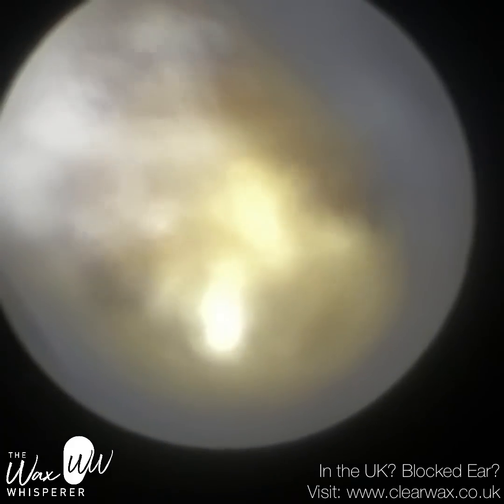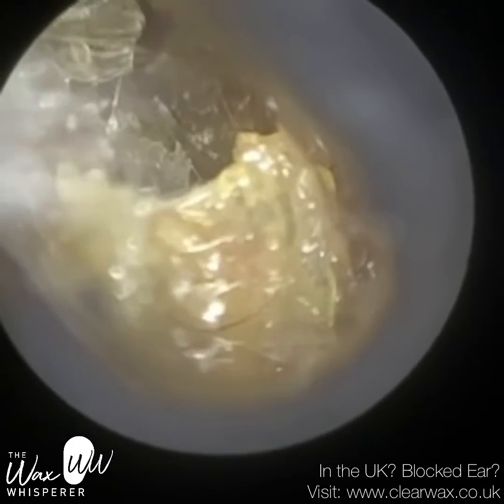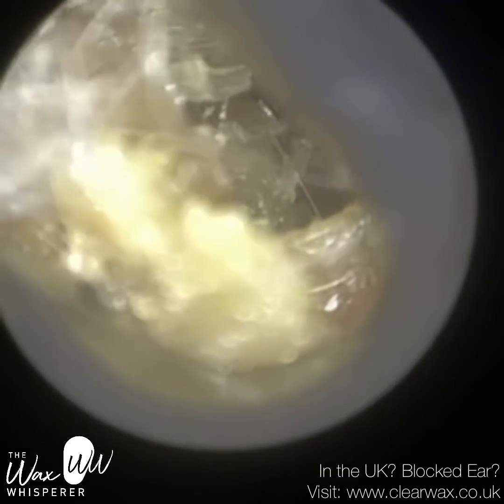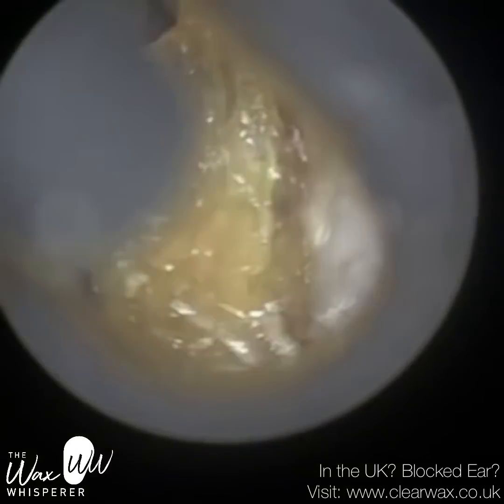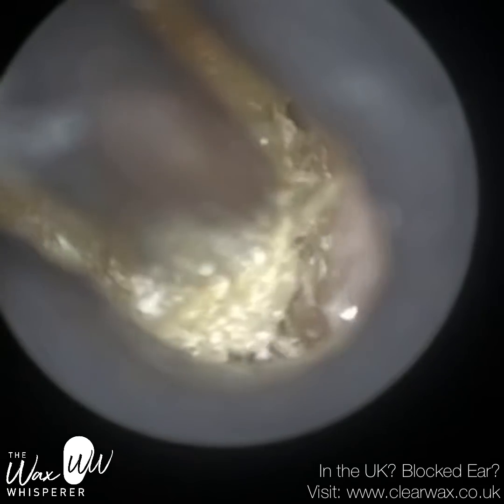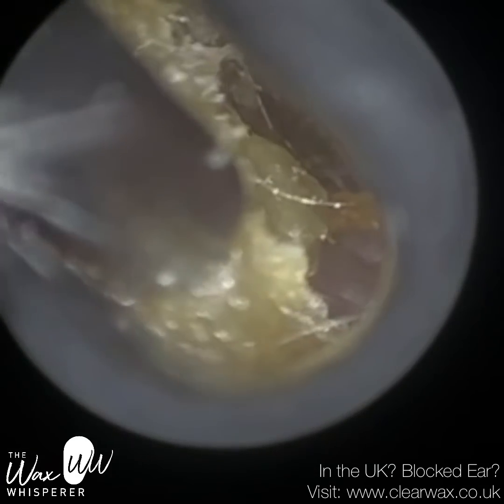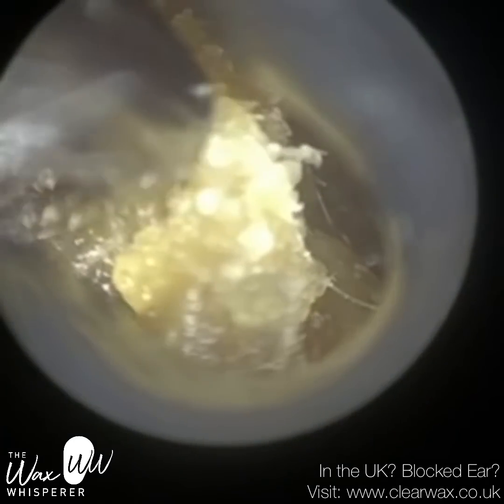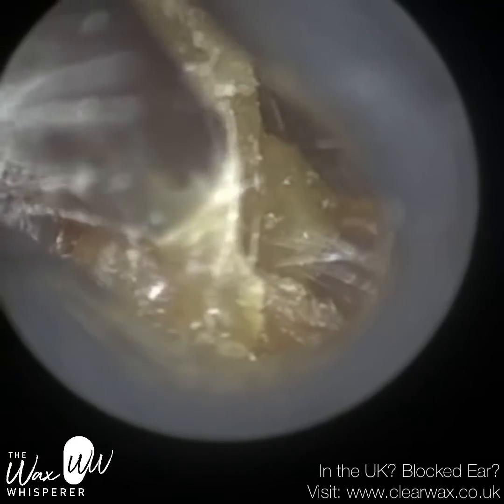That's the left ear. Now this is the right ear — the narrow ear. If you are having your earwax removed and the individual is using goggles or an ENT microscope to look in your ear, this is the view that they're looking at. I'm using a really narrow speculum — we've got four different sizes and this is the 3.5mm, the narrowest one, because this patient's right ear is narrower. Hence why I thought we need to put the device through its paces and really test it out. This is a really good ear to test it on.